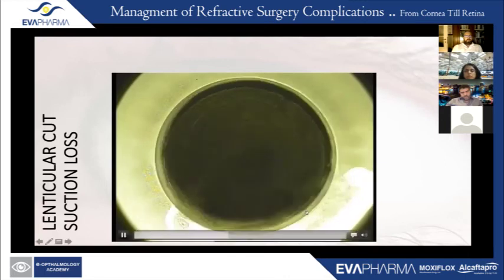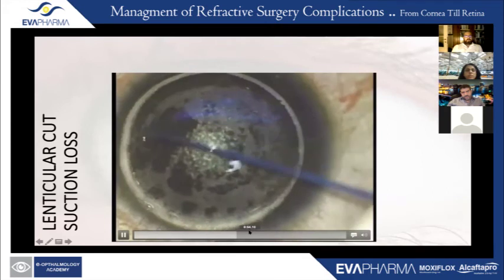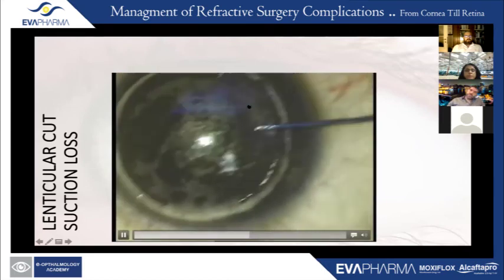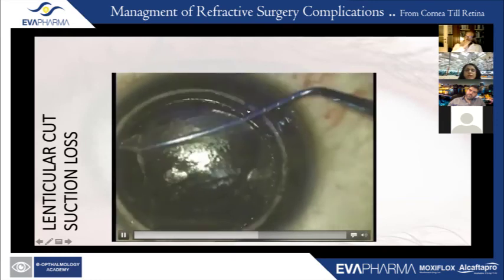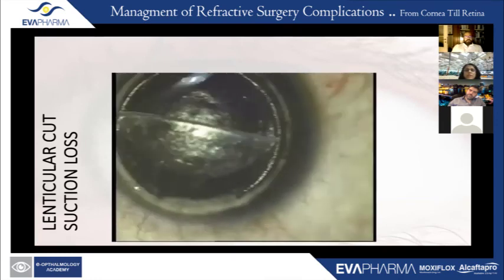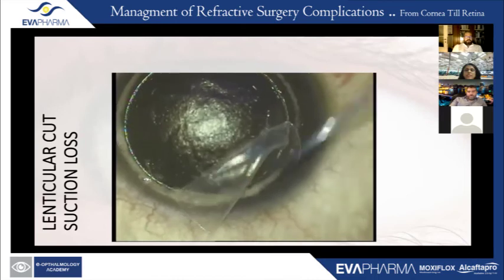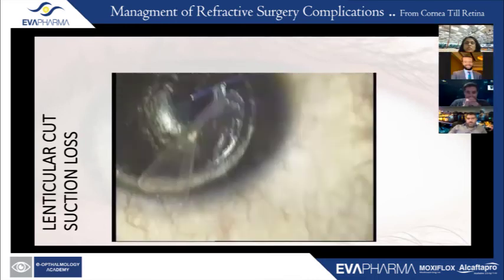So this was an interesting case because it shows the possibilities that can happen when you have this double dissection. So here you can see that what I'm doing is dissecting off or lifting up that femtolasik flap, and you can see that there's that area where both the previous dissection as well as the present dissection have kind of overlapped with each other, and there's that strip of tissue which is actually going between the two areas of dissection.